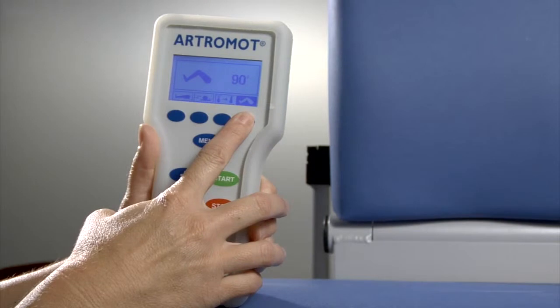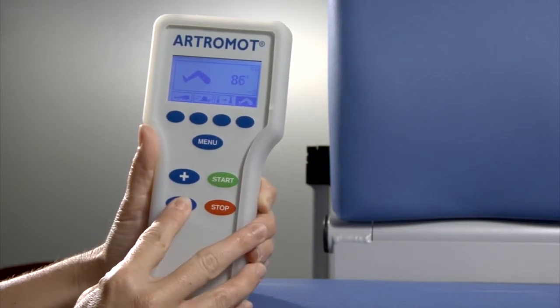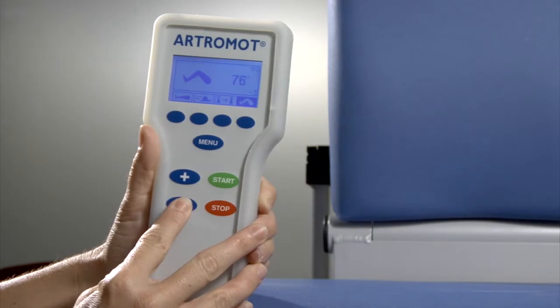On the right side of the display, you will see the picture of a bent leg. This is the symbol for the flexion setting. To adjust the flexion limit to your prescribed or desired limits, press the blue button below the flexion setting and change using the appropriate arrow.